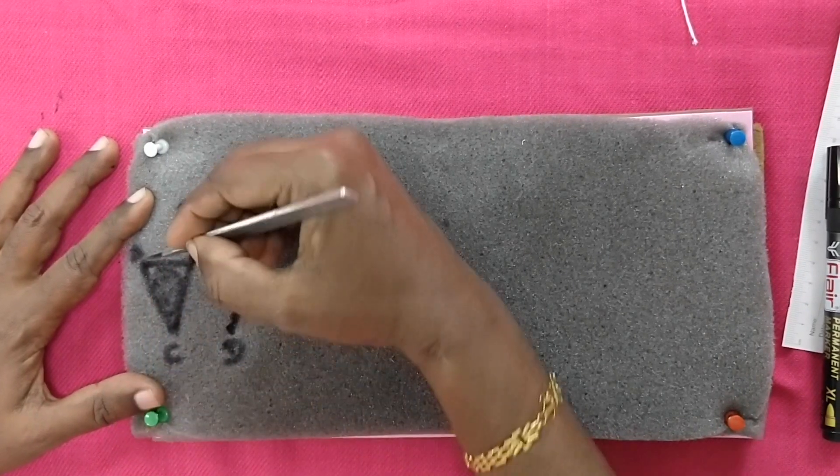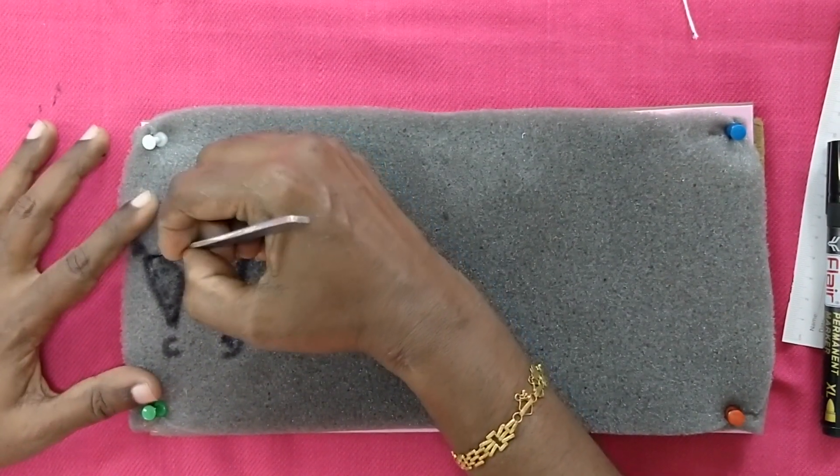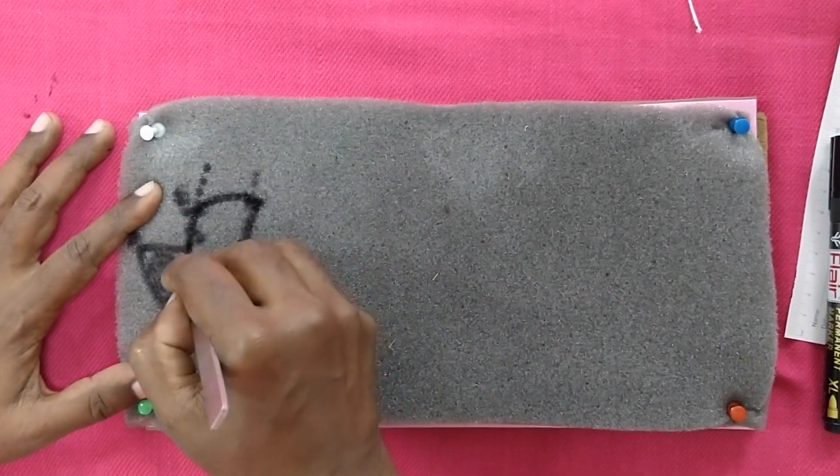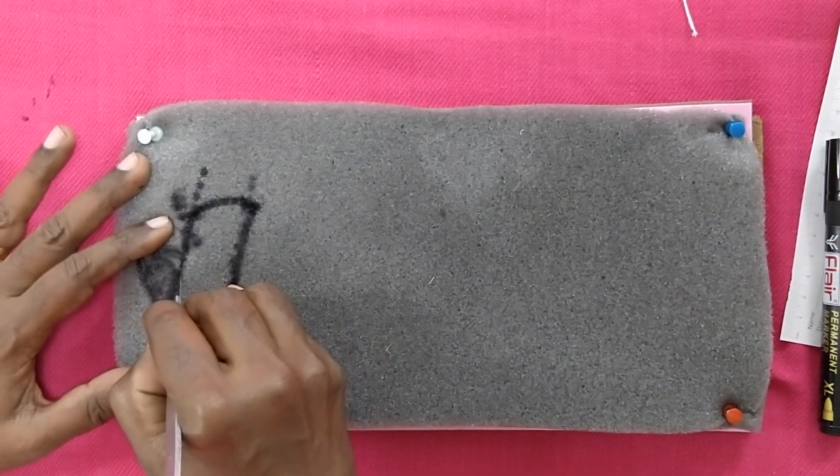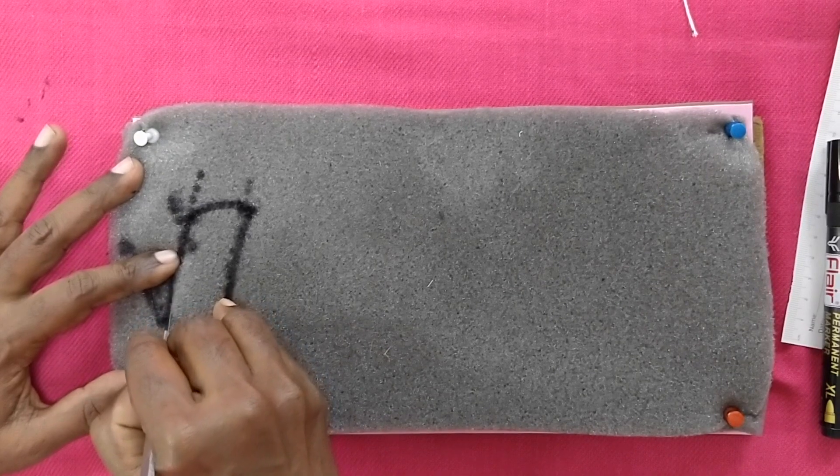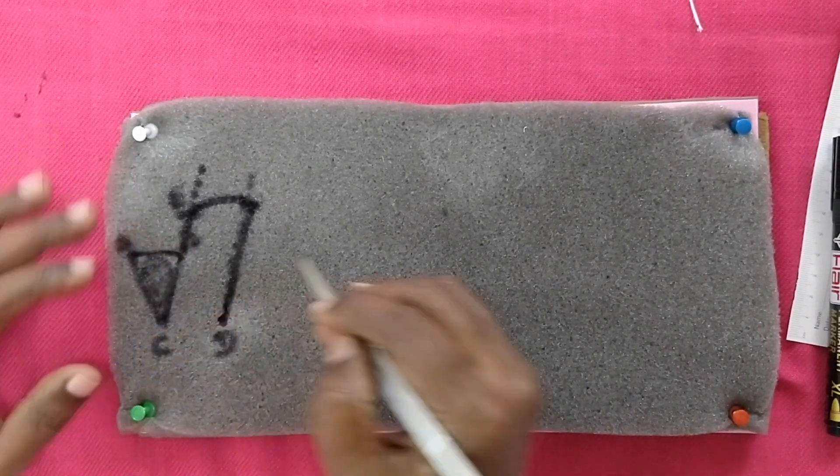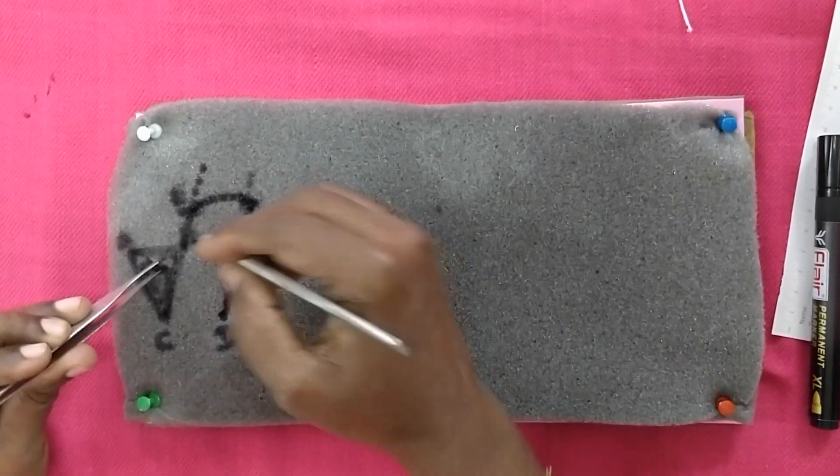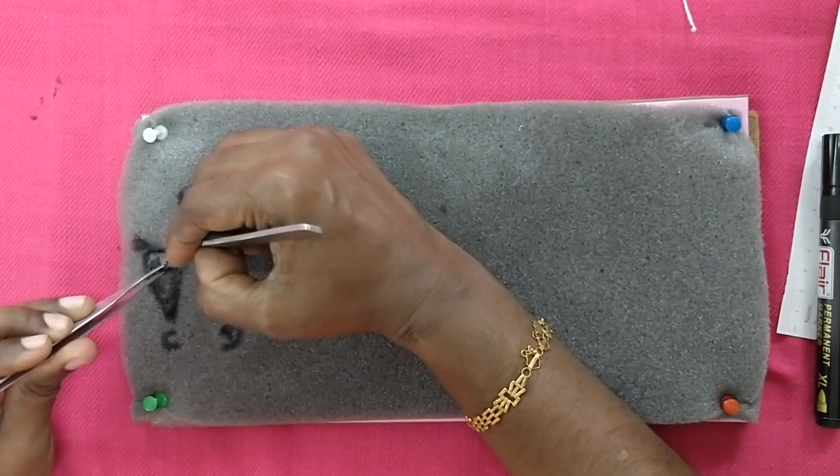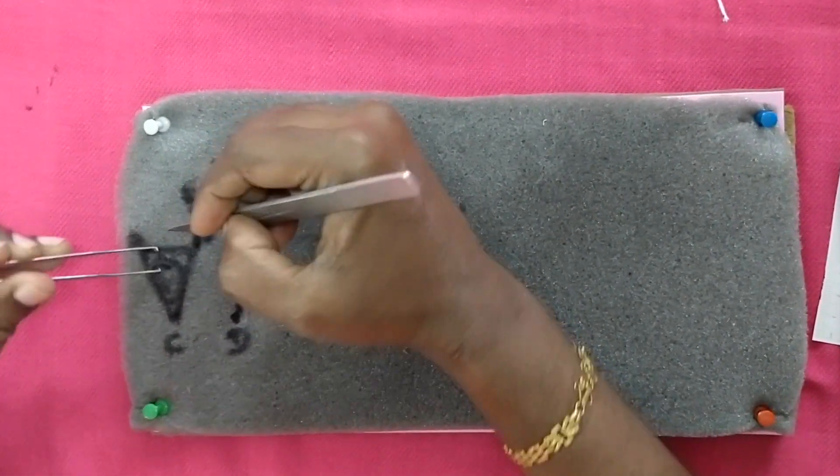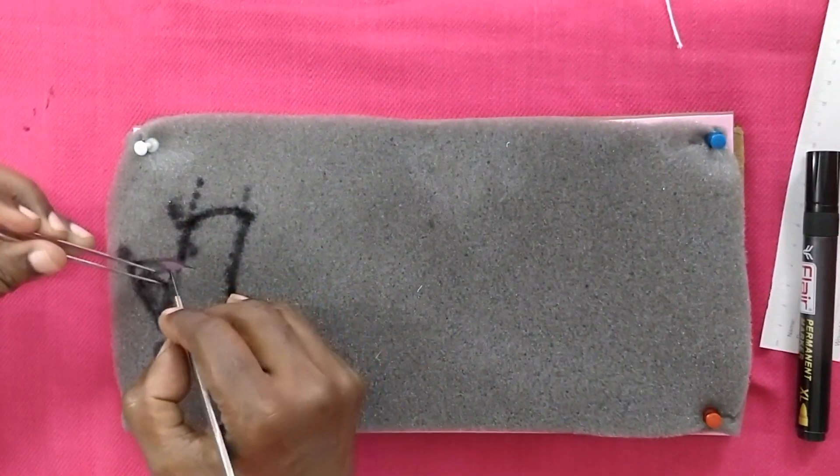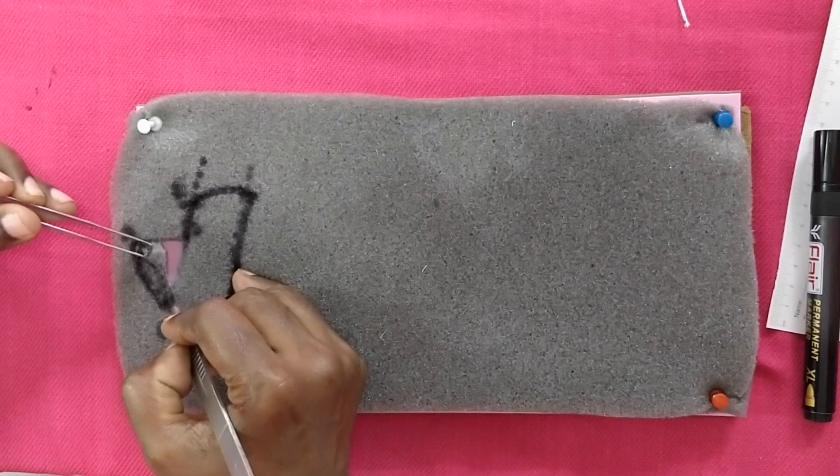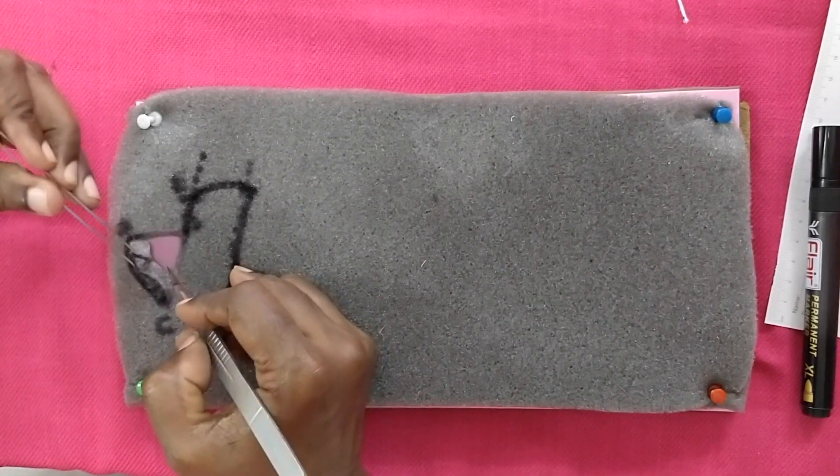So this is going to be the triangulated defect for which the flap is going to be transposed. The debridement must be clear and here since there is a pink foam underneath, the debridement must go up to the pink foam.